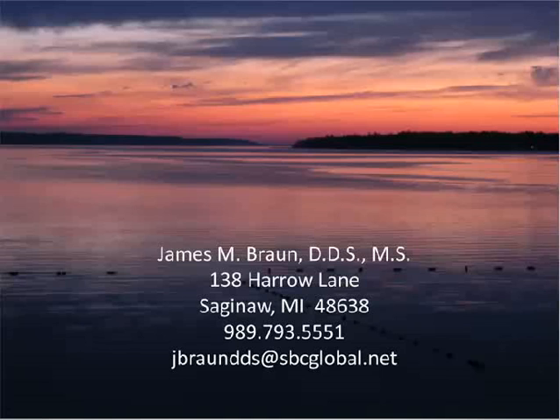Some of these are rather large and kind of bulky to deal with. You have to have margins which are easily identified, and you also have to have enough time to do it. There's the learning curve, the cost. You're not going to get a better fitted crown by using a digital impression, nor will doing digital impressions make it any easier to get accurate impressions.